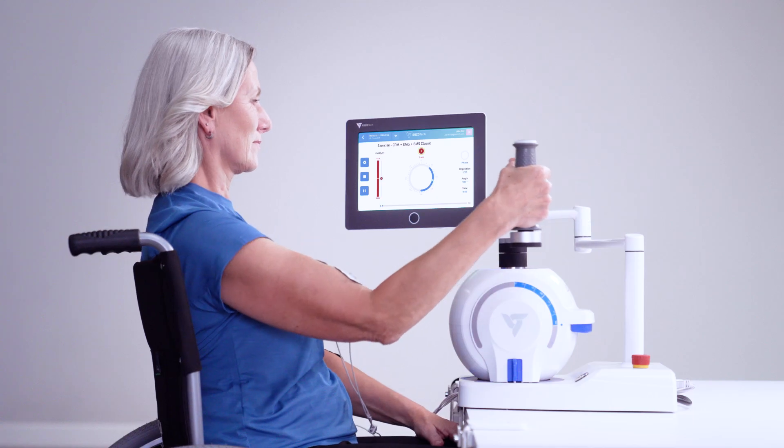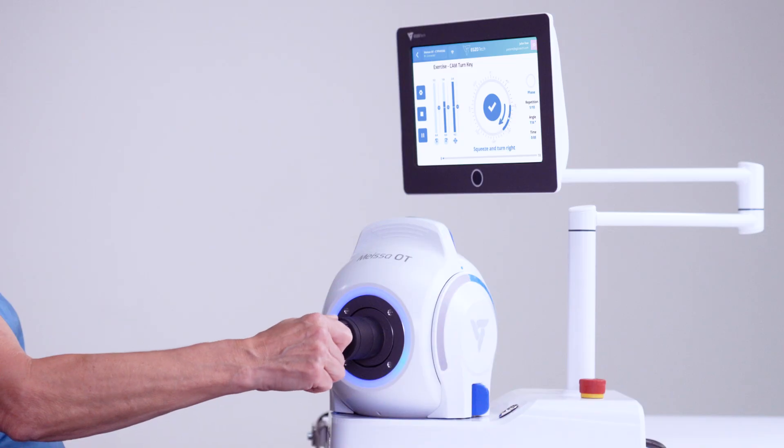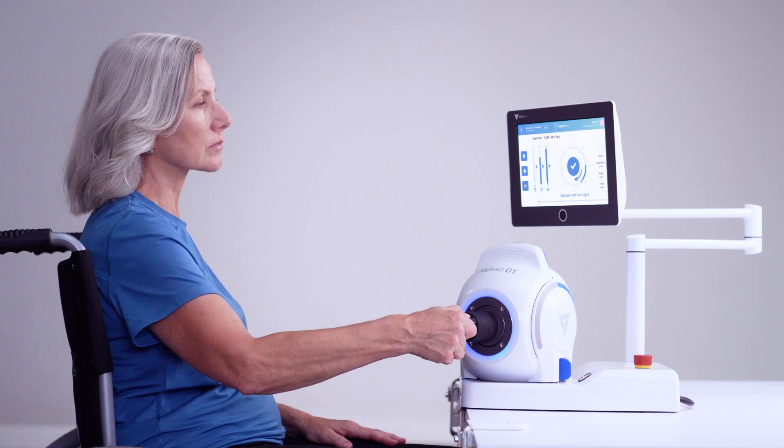We can achieve more complex upper limb movement using the stirring extension. Patients' pinch grip can be trained and evaluated through a specially designed key extension with pressure and range of motion biofeedback.